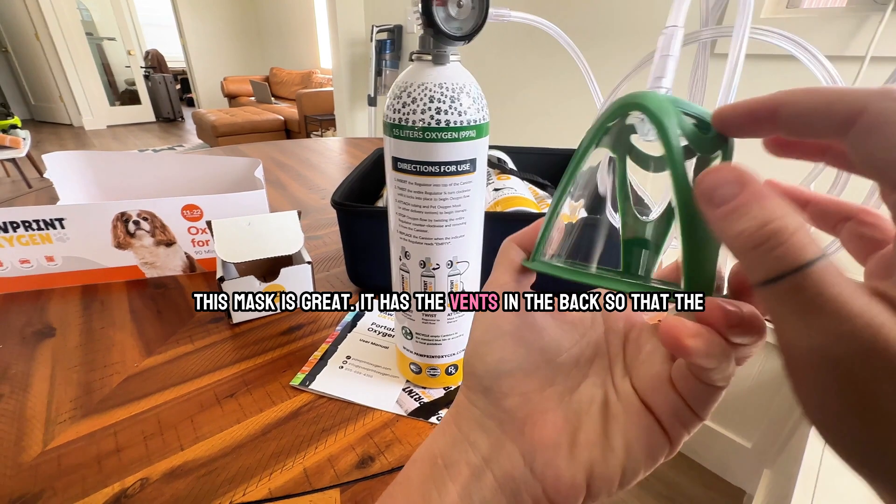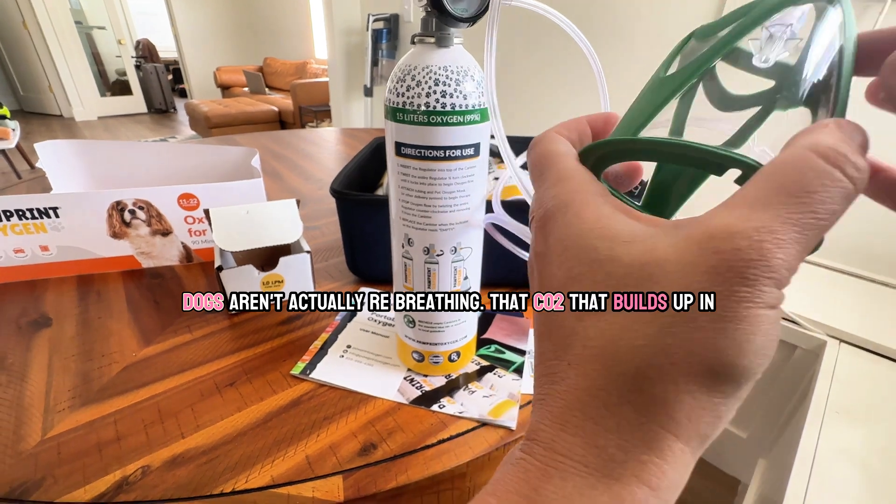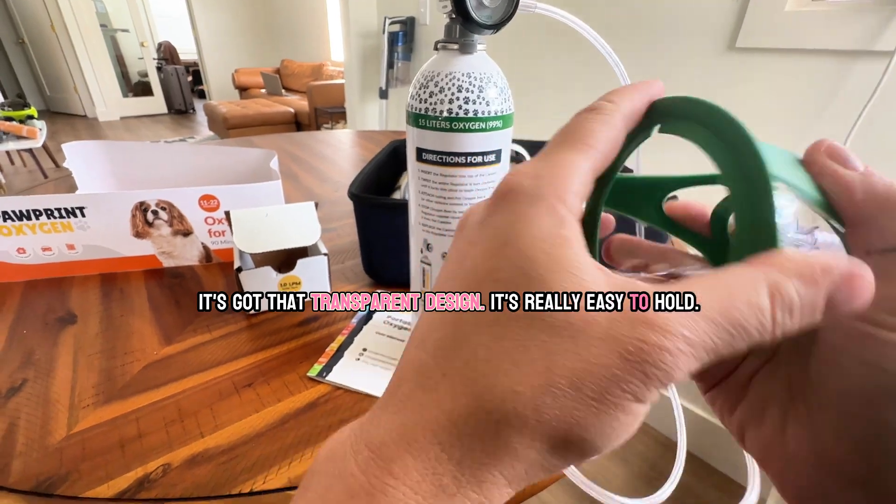This mask is great. It has vents in the back so the dogs aren't actually rebreathing the CO2 that builds up in the mask. It's got a transparent design and it's really easy to hold.